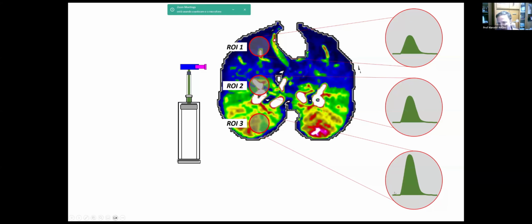So when you see this curve, you can observe that it has a higher slope and a higher amplitude. You can pick up one of both, the slope or the amplitude, and there are some demonstrations that the slope is even better than the amplitude to track the perfusion in each pixel of the image.